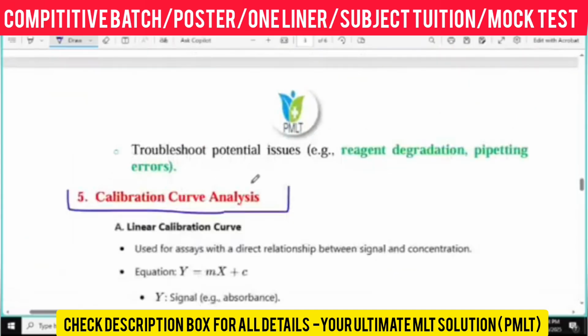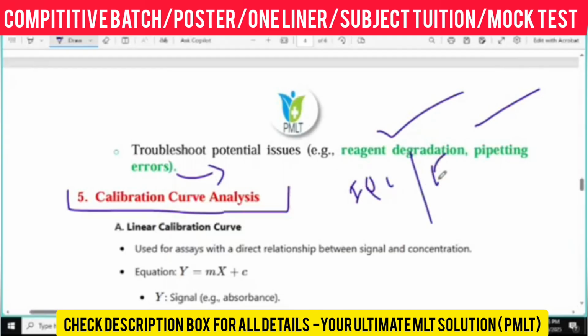Okay. Now, see, troubleshooting: potential problems might happen. There could be reagent degradation, pipetting error. So we have understood the quality control, internal quality control and another one, external quality control, right? Can anyone tell me, pipetting error, which type of error is it? Internal error, sir. Analytical error. Very good, it is an analytical error.